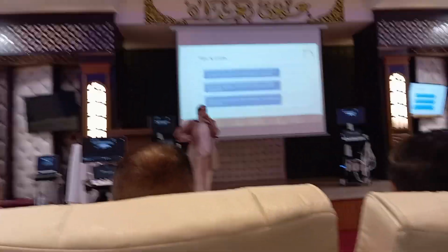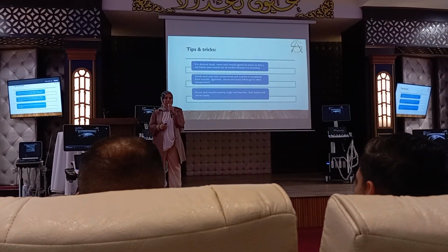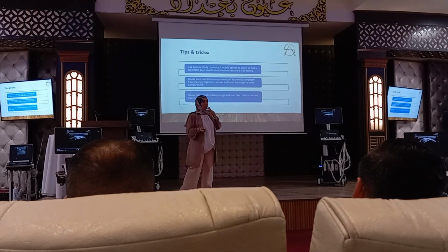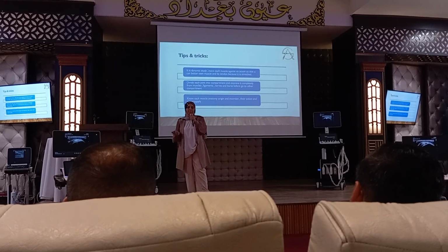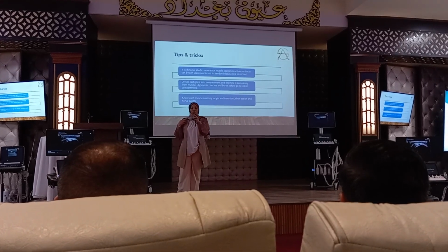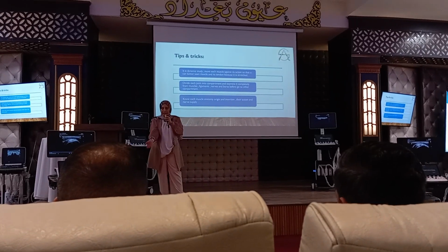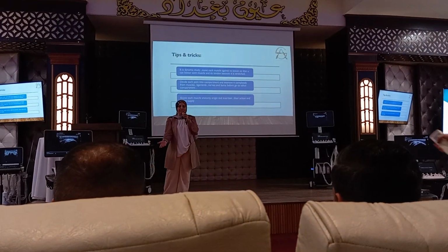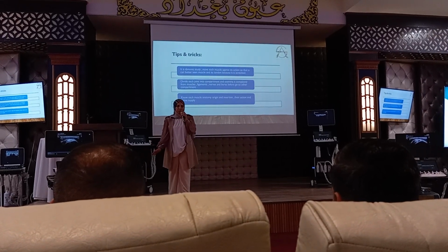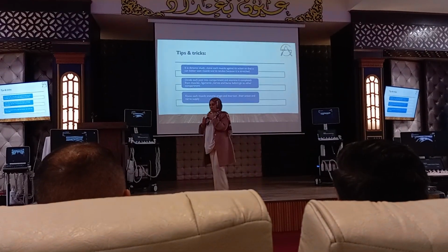Do not do this movement and this movement and this movement and not know why. So this is the most important thing of this workshop. To give a systematic review of shoulder ultrasound, or even any MSK ultrasound, we should divide each joint into compartments. For example, shoulder into anterior and posterior compartment, elbow into medial, lateral, anterior and posterior compartment. Why do that? It is a systematic review in order not to miss any structure to examine it. So this is the most important thing.